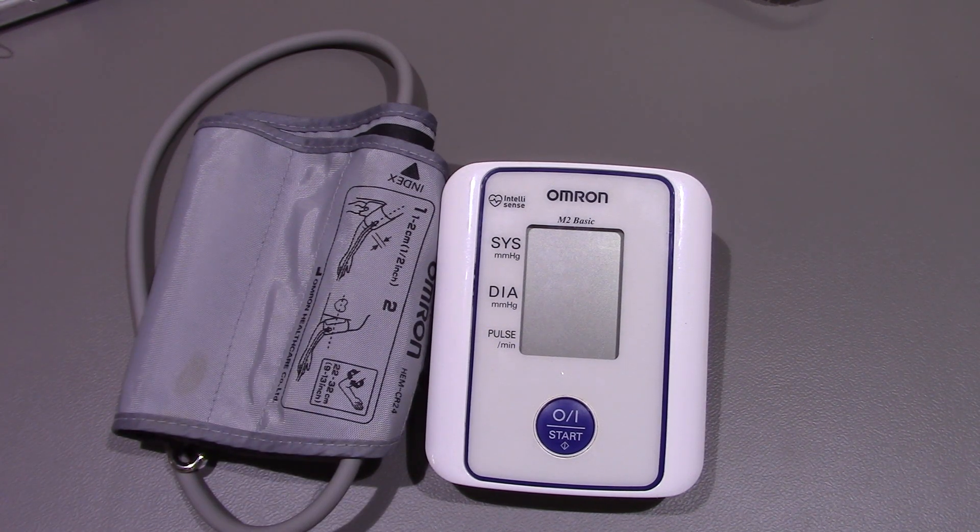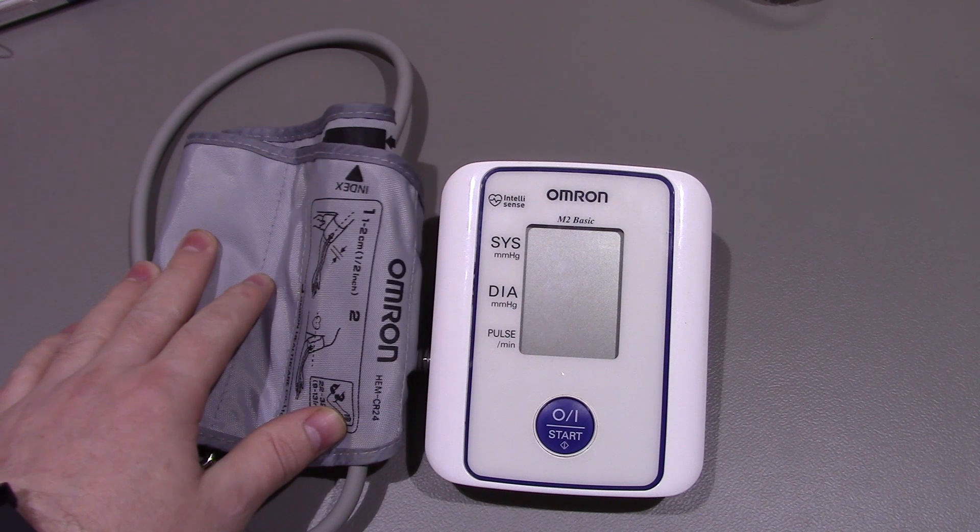It's got a bit of a fault with it. Sometimes it just doesn't seem to read at all - it basically doesn't inflate the cuff properly.